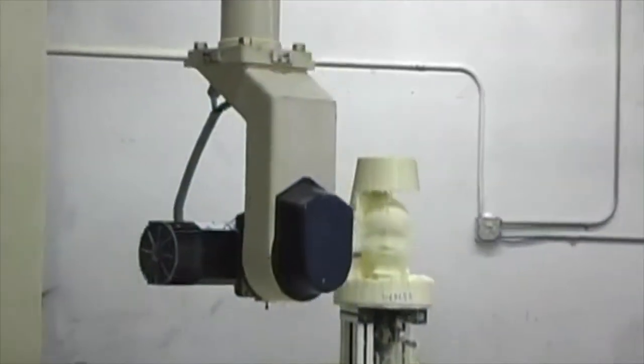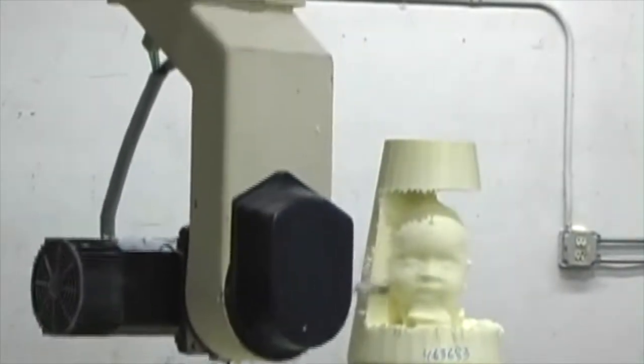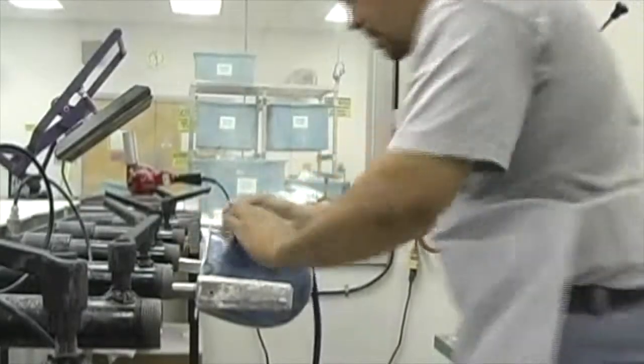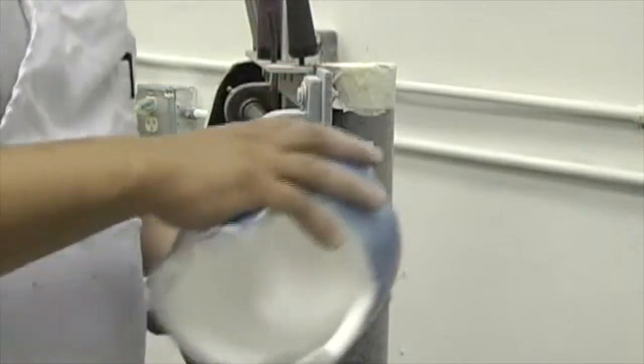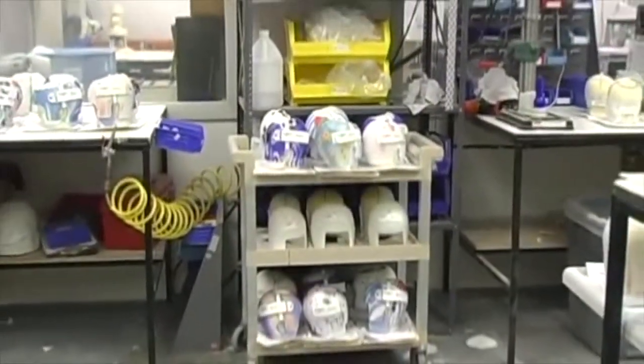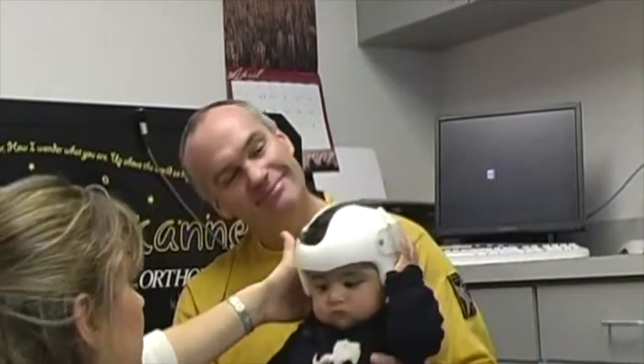Once a scan is taken, it is immediately sent to OrthAmerica to carve the three-dimensional head-shaped mold for fabrication. Each mold is modified to improve the symmetry and proportion. Once the modifications are complete, the foam and plastic are heated and thermoformed over the mold to create a Star Band that will address each baby's unique head shape.